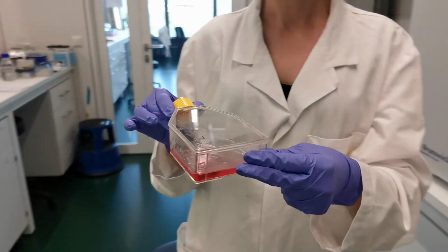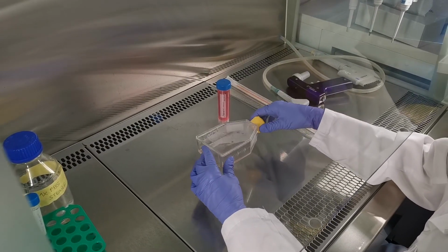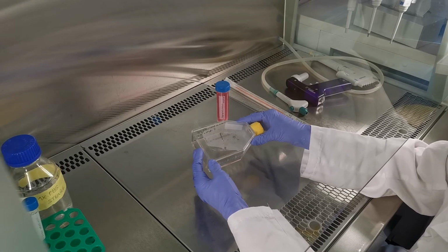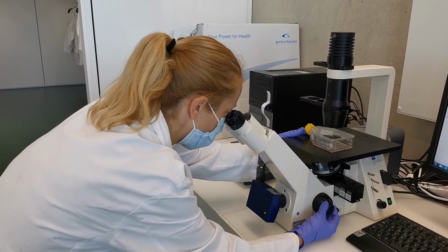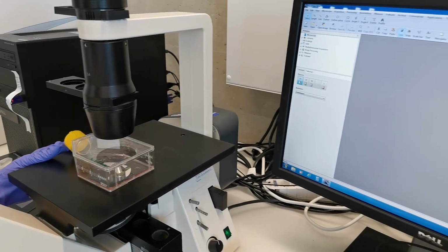Following the incubation at 37 degrees, tap the flask to ensure that the cells have fully detached. To confirm that trypsinization has worked and the cells are detached, these can always be checked at the microscope under a bright field setting.